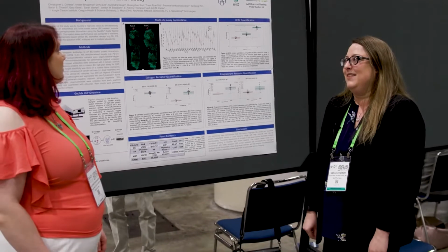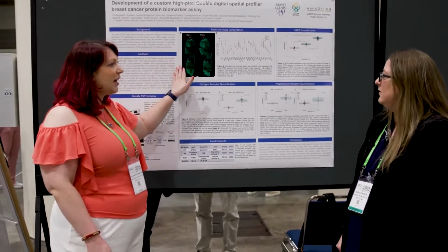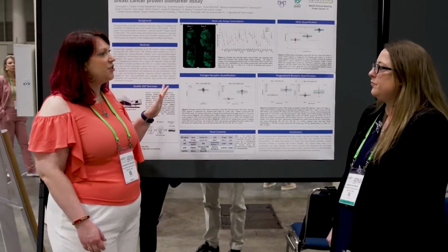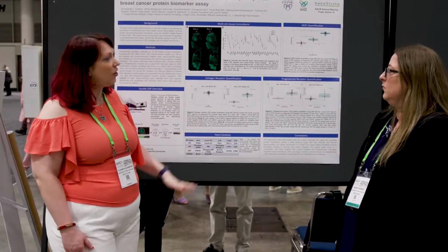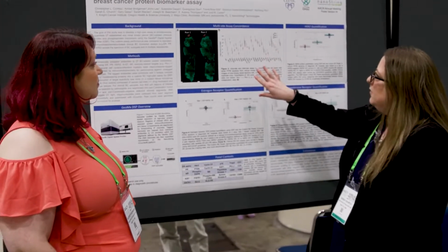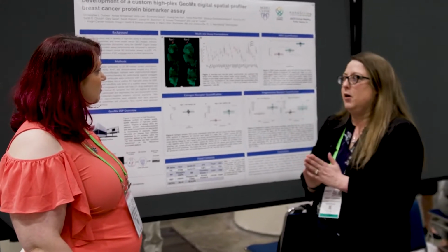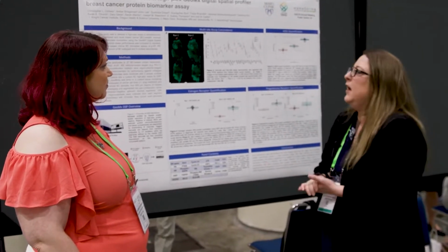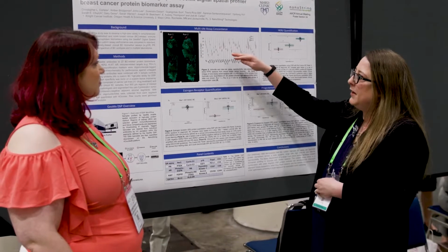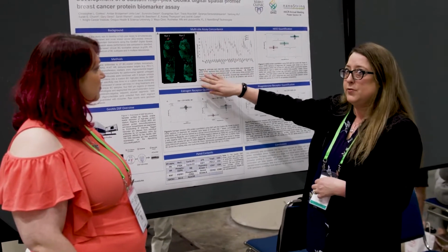Yeah. Excellent. And then can you walk us through how the regions were selected? What regions of the tissue were selected to profile? Yeah, absolutely. So in the initial concordance assays, they basically selected the same ROIs at all 3 different sites. And they were really picked in order to have both coverage of tumor as well as stromal areas.